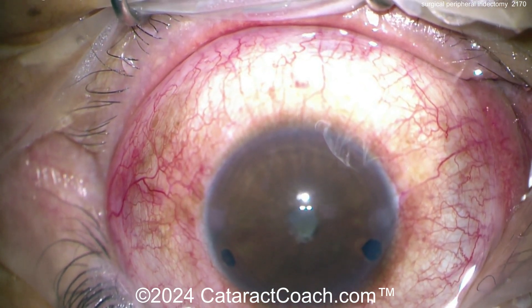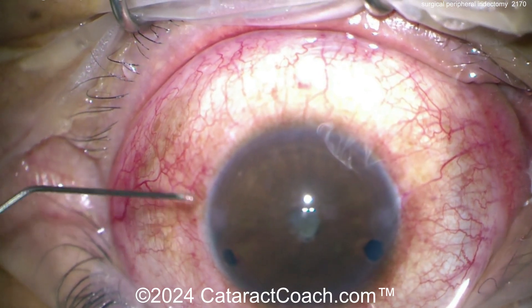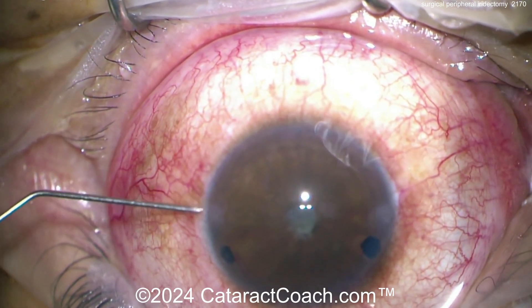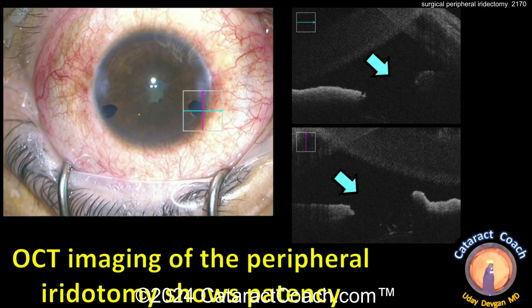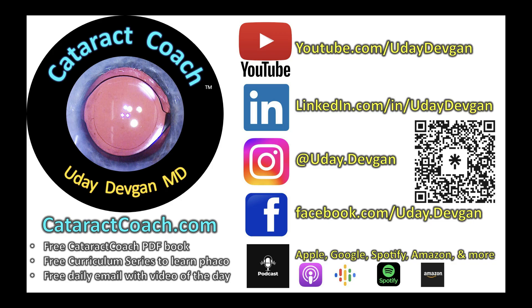Note that the speculum is not under the lower lid there, but it's a good case. Now you know how to do both types of surgical peripheral iridectomy. Here's the OCT image showing the one made with the vitrector — beautifully open, and that looks great. Check out the weekly podcast — there's so much more to learn.